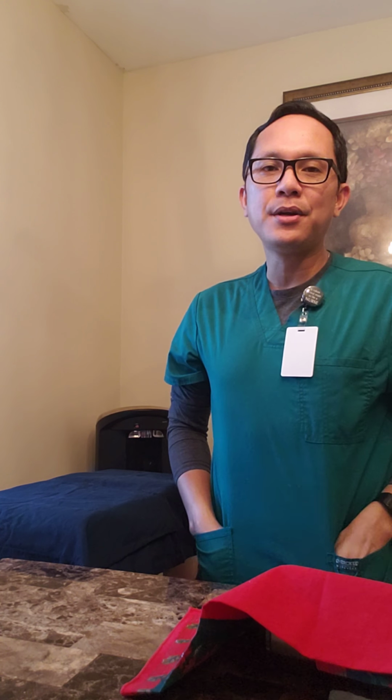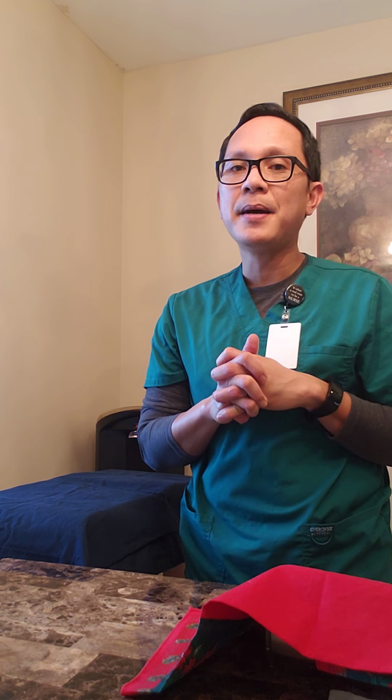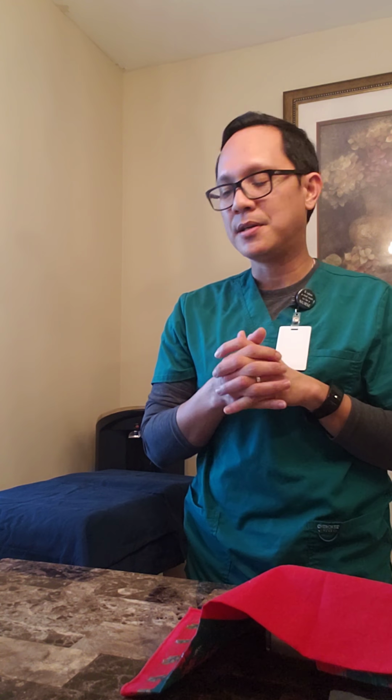Today I'm going to be showing you how to insert an indwelling catheter, or a Foley insertion. Today I have a 50-year-old female patient who has cancer and she's been having a hard time urinating for the past couple of days, and hence the doctor ordered a Foley insertion to relieve the pain that she's feeling and to alleviate the distension of her distended bladder.